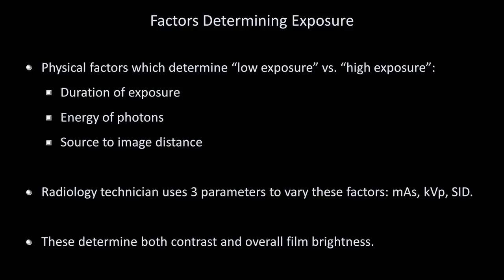The technologist has a good deal of control in varying these parameters in different situations, such as extreme body habitus or an unusual SID. However, in general, they should be kept as consistent as possible from one exam to the next for the same patient. Otherwise, clinicians would not be able to tell if changes that occurred from one X-ray to the next were due to an actual change in clinical status, such as increasing or decreasing pulmonary edema, or were due to difference in radiographic technique.